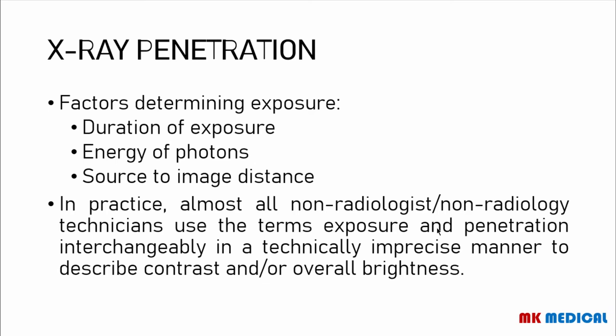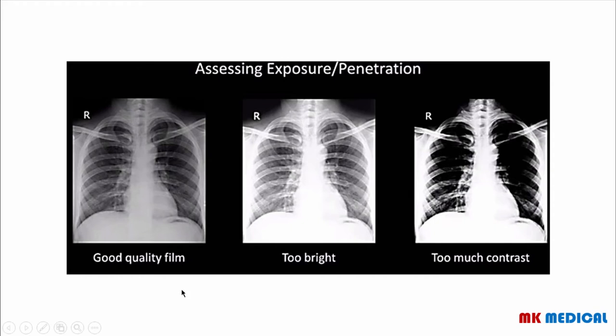But what you really need to note is that in practice, almost all non-radiologists are going to be using the terms exposure and penetration wrongly. They usually use them interchangeably, but it's not really precise, because they usually use these to describe the contrast and the overall brightness of an image. But because it's been used so many times, most people tend to just go with that. So here is a good quality film. This is an X-ray which is too bright. This is an X-ray which has too much contrast, so it appears too dark.